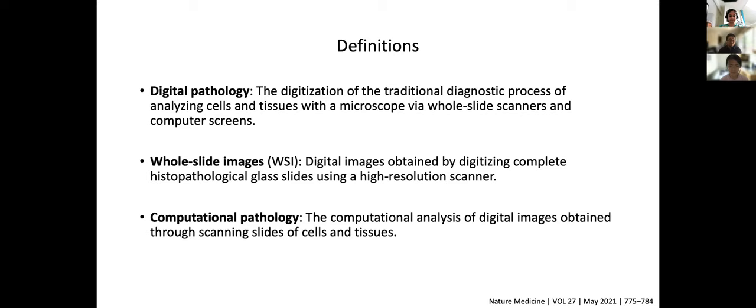And whole slide images are the digitized version of the images obtained by high resolution scanners that scan the entire histopathological glass slide at the resolution of a microscope. Computational pathology is the computational analysis of those digitized whole slide images, automatically analyzing those cells and tissues on really high resolution images.